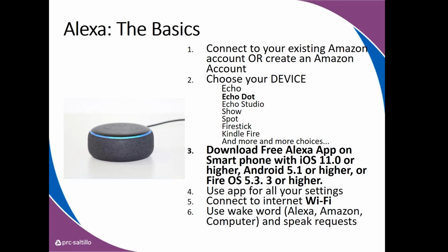Does that feel okay? If you need more support with actually getting your Alexa started and figuring out devices, there's great support through Amazon and Alexa websites, and lots of great articles on the web too. But in order to use it with your AAC user, you need to get it going. And for some, they already have it and don't know how to use it. But for others who have been thinking about Alexa, maybe this will help you feel a little more comfortable moving to the next step. Okay? So far, okay? Any other questions so far?